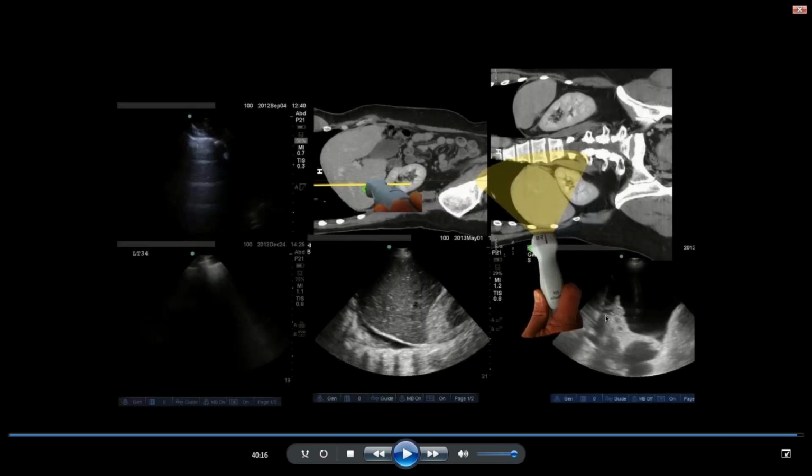Mike, what is your preference? I am at a loss for what to add to that. The one thing I can suggest, and this may be specific to my eye only, is changing the preset you might be using. If you do not have a lung preset on your machine, especially for the linear, I find that using a vascular or venous type preset for the linear probe helps me bring out sliding lung more easily, as opposed to, let's say, a breast preset or some MSKs. But then the pleura may be better defined in an MSK preset.